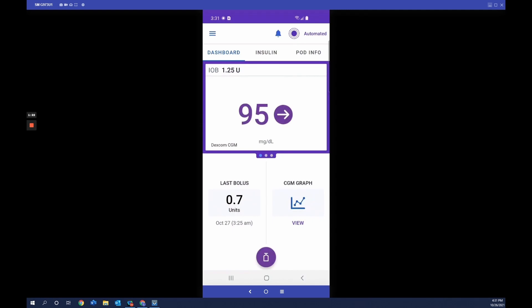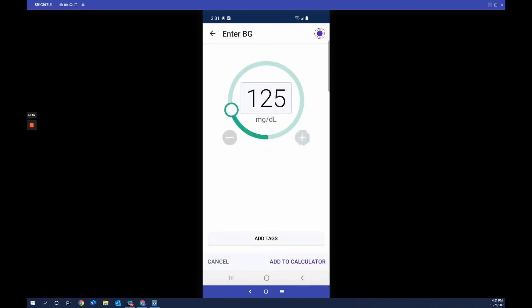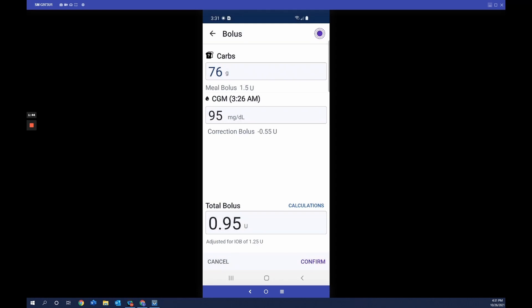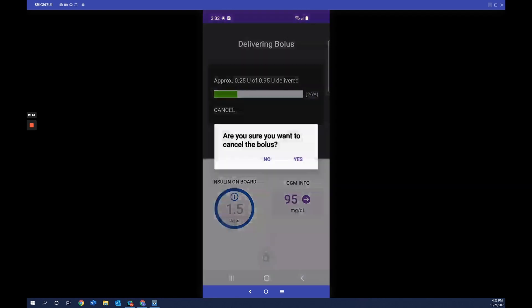To bolus for food, tap the bolus button to open the smart bolus calculator. Enter the amount of carbs, then either enter blood glucose manually or tap 'Use CGM.' When you tap Use CGM, the smart bolus calculator uses both the CGM value and trend in the calculation, giving a little more or less insulin based on the CGM trend to bring glucose close to the target. Tap Confirm, then Start — the app sends the information to the pod to begin bolus delivery, and you receive an audible confirmation once delivered.